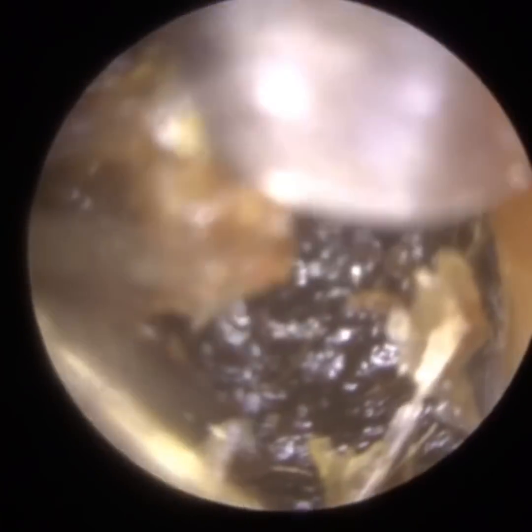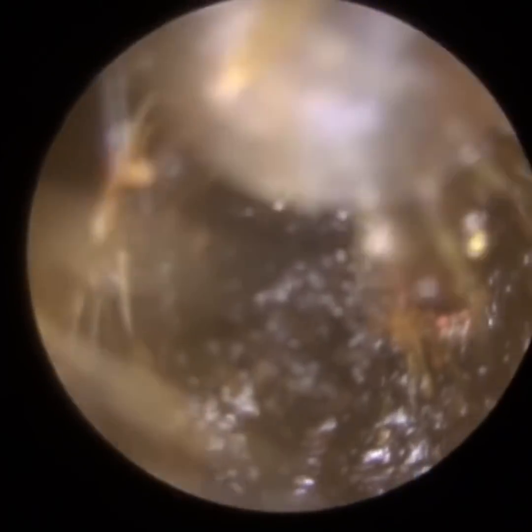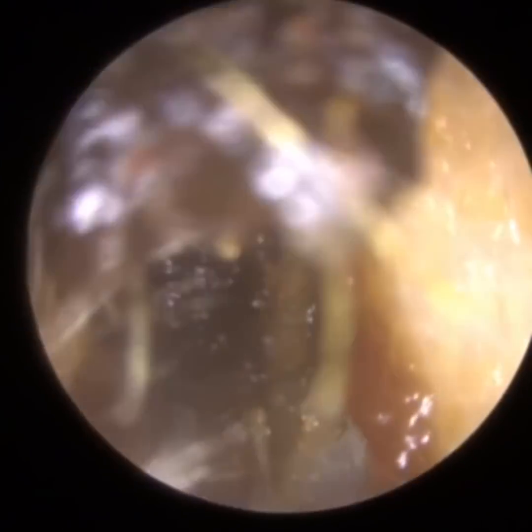The patient suffers from bilateral eustachian tube dysfunction. They had some grommets fitted, I think, at the beginning of the year. They only lasted for three or four months. The right grommet is embedded into the wax — you'll see it in a moment when I remove the plug of wax. I think it's in the next plug.